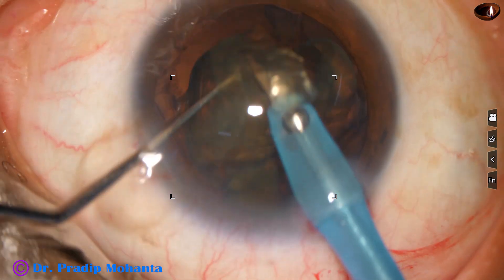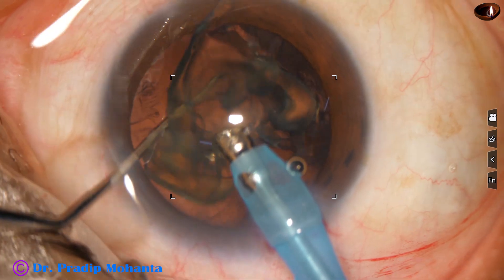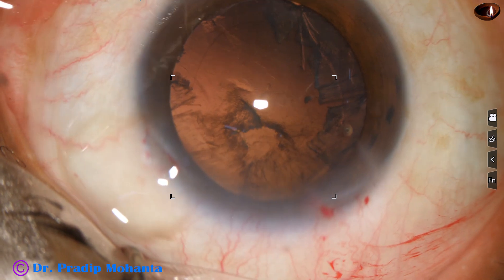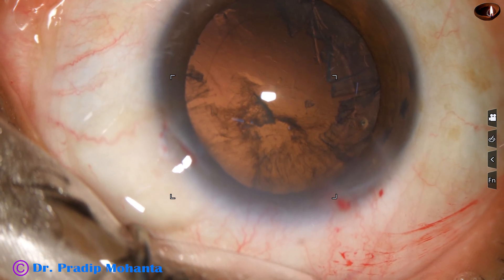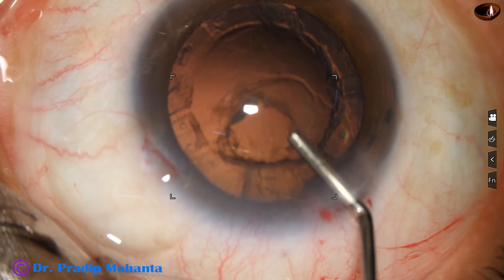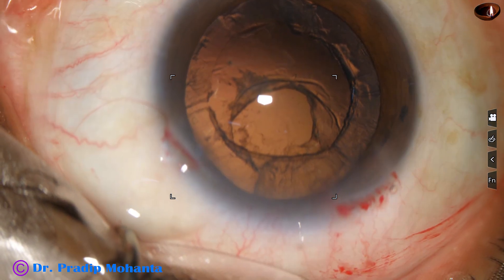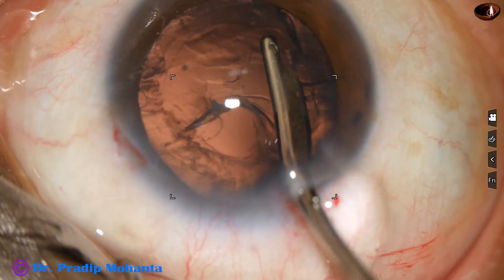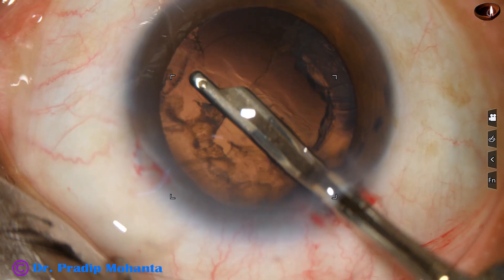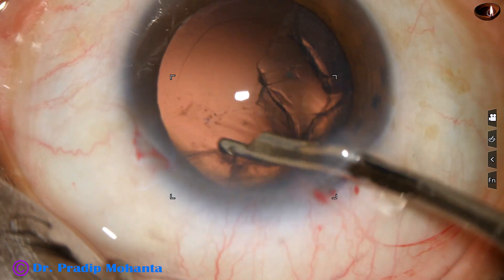See how easy it is to pick up the nuclear pieces and emulsify them once you have divided the nucleus into four pieces or even three pieces. Just divide into two hemi-nuclei and divide one hemi-nucleus into two fragments and you can manage the nucleus very easily. Now some viscoelastic and we have to remove the cortex. We can use coaxial irrigation-aspiration, but a Simcoe is quite good. Simcoe is very safe — the control is in your hand, not in your feet.